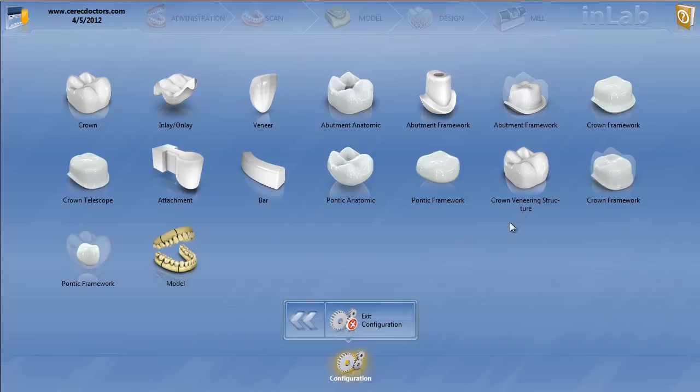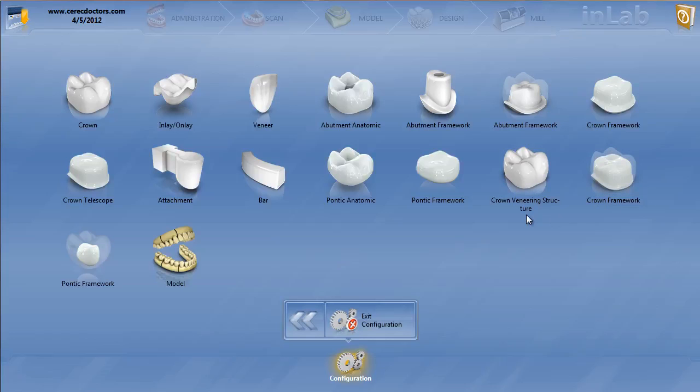So these are very tricky parameters. You have to think of multiple things when setting these parameters: the spacer of the framework, the minimal thickness of the framework, the spacer of the veneering structure, and the minimal thickness of the veneering structure. It's probably one of the most complicated things in in-lab 4.0 is getting these right. So let's start with crown veneering structure.